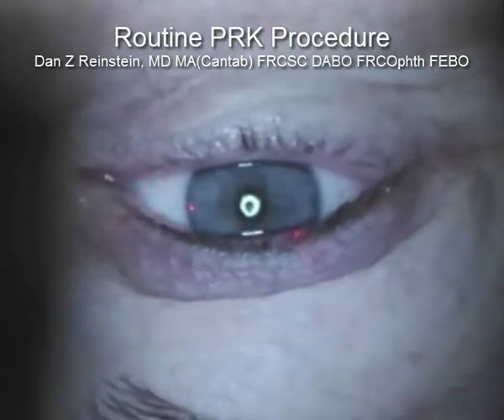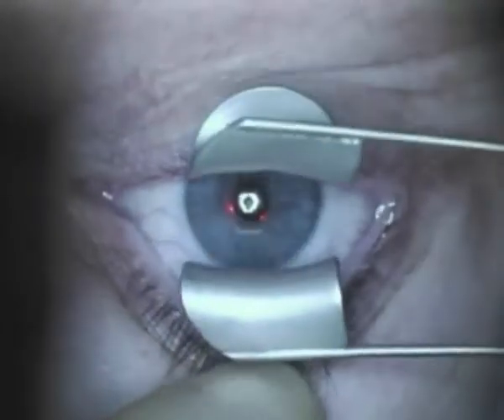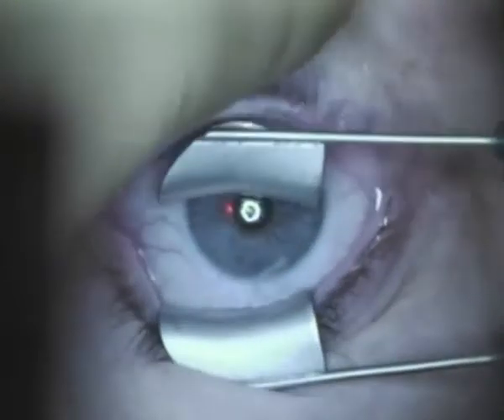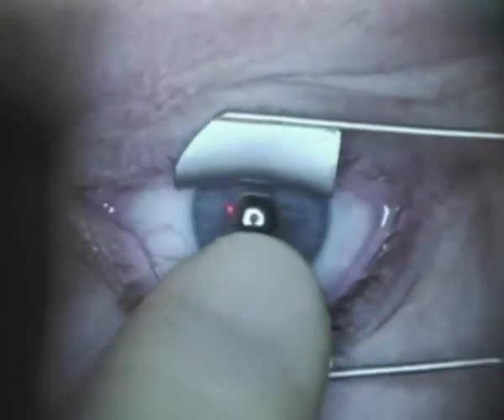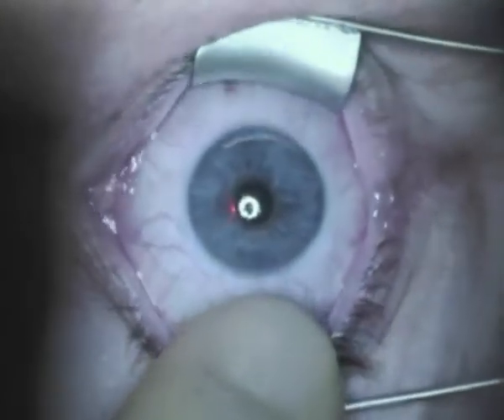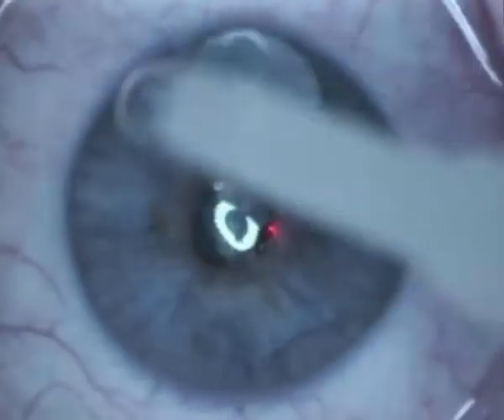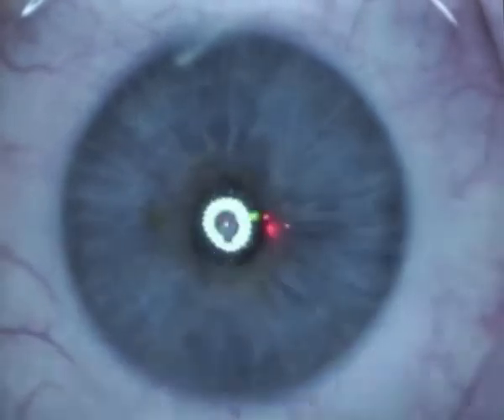This is Dan Reinstein, and I'm now going to go over a routine PRK procedure — PRK, otherwise known as advanced surface ablation — where we are removing the epithelium with alcohol and placing a bandage contact lens in after the procedure.